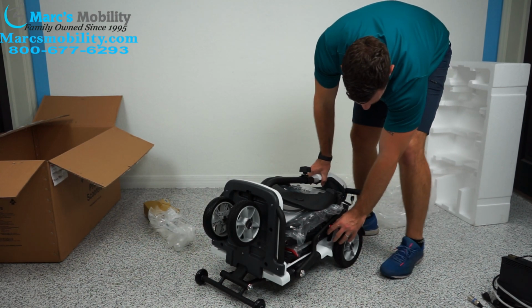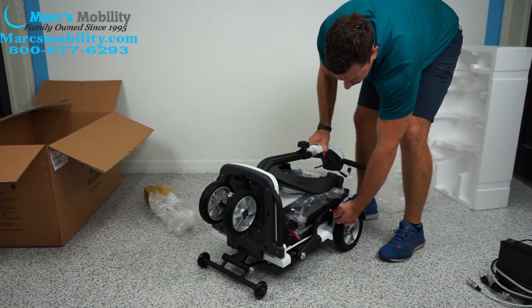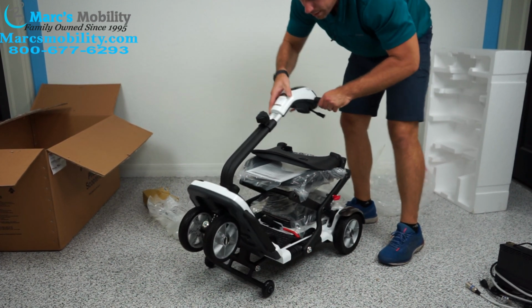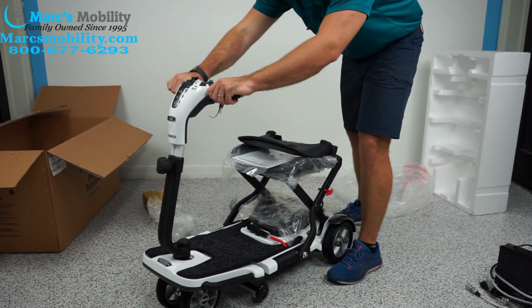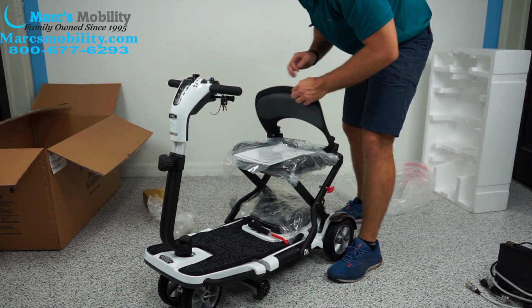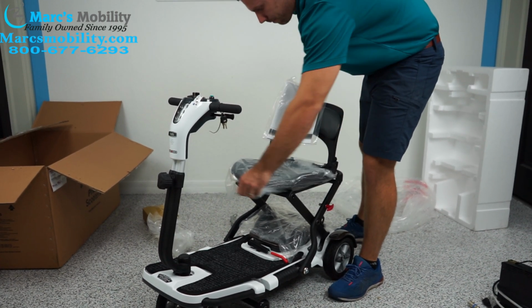So over here on the side, you have a red handle. If you pull that handle out, it's what allows the scooter to fold and unfold. So you pull this handle out, spring loaded, and then you want to go till you hear it click. If you don't hear it click, then the unit's going to want to fold back down on you. Fold your seat up.